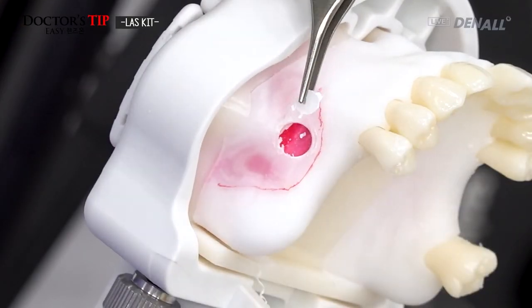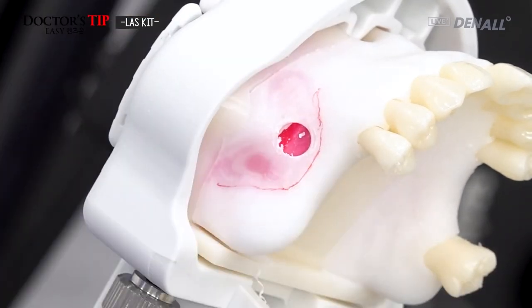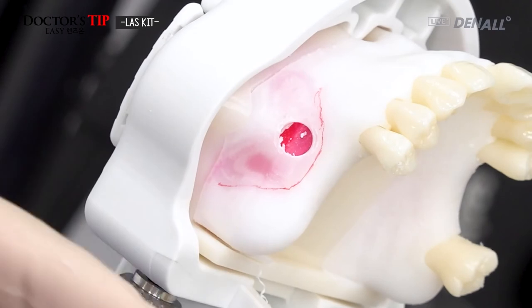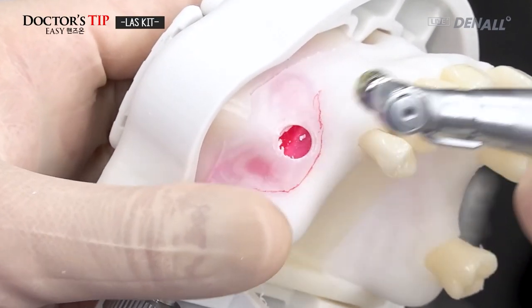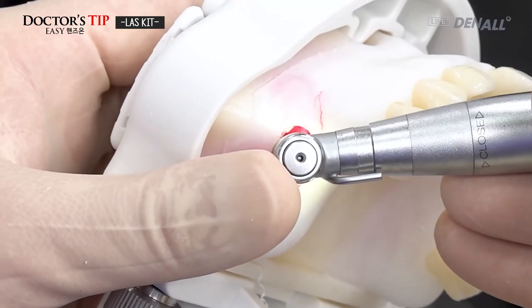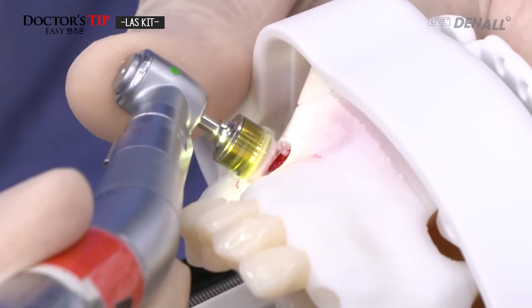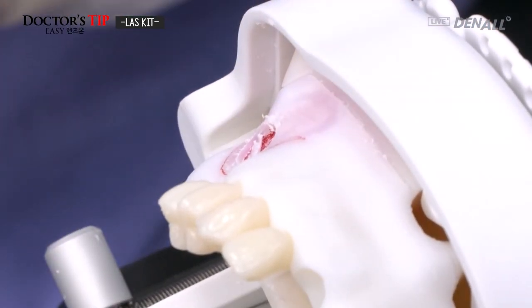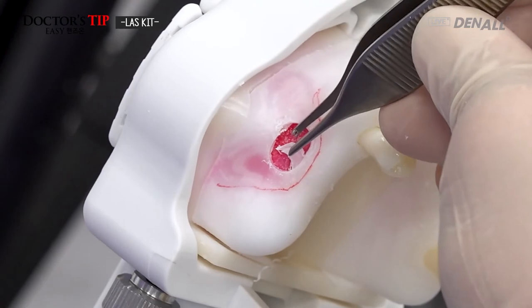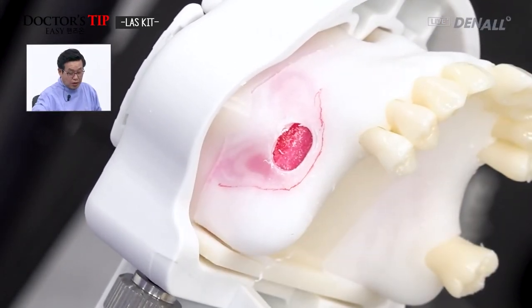So we detach the window, and as you can see, just in case the hole is too small, sometimes you can create one more hole right next to it. And then as you can see, a bit wider window will be available.